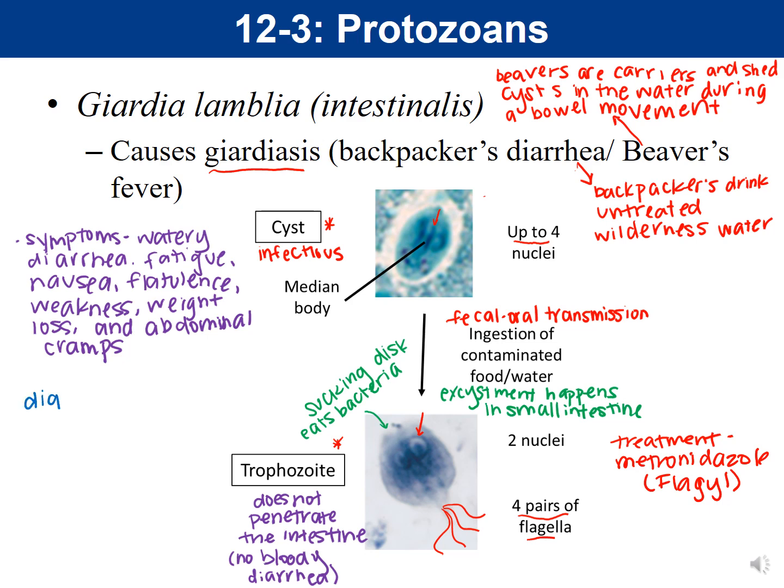So diagnosis is stool sample to identify cysts or trophs. So again, you would use a stool sample and you would look for the presence of cysts or trophs.